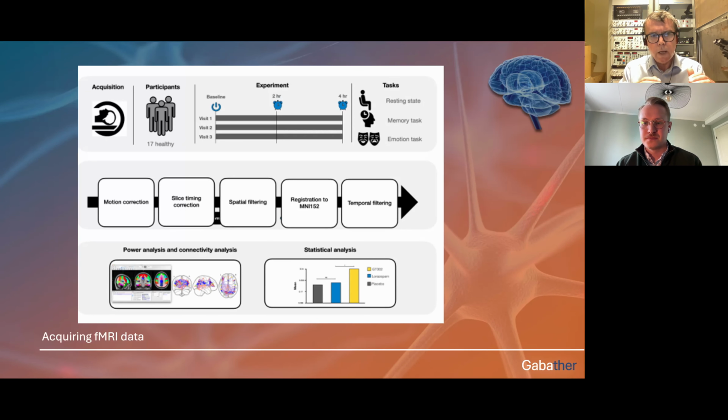So in the participant group, the main thing was to make the baseline now. And now we can see what happens in the EEG and the healthy volunteers. And of course, this information will go directly to what areas of the brain are affected. Okay, now we know where to look double or triple or 4 times as closely as possible in the patients. It's a little bit like looking for a needle in a haystack: it's a good idea to know, okay, this part, the lower right-hand corner of the haystack, let's look 2 or 3 times more closely than all the rest. I think that was the basis of the idea behind this fMRI EEG study as a bridge to the patients.